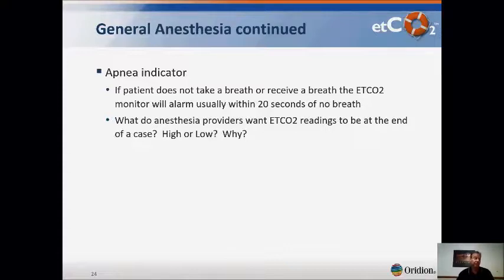This is a question that's kind of interesting. What do anesthesia providers want end-tidal CO2 readings to be at the end of a case? Do they want them to be high or low? Well, if you think about it, they want them to be at a point that would stimulate a patient's breath. So if CO2 is low, they've been hyperventilating, and thus they're not going to have a whole lot of drive to breathe. So at the end of the case, sometimes they'll turn off the ventilator and not breathe for a patient for a couple minutes so that the CO2 is building up in their system.